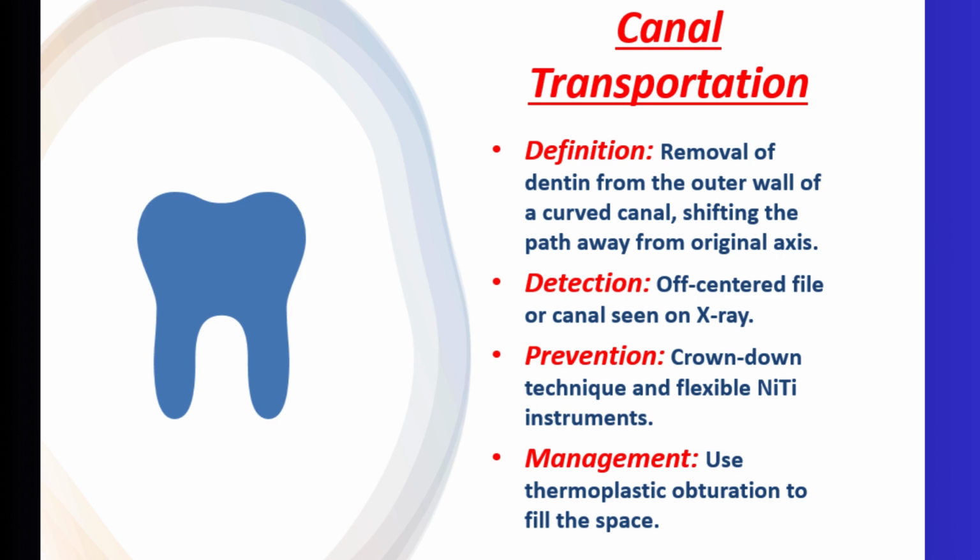Prevention: use flexible NiTi instruments. Respect original canal anatomy. Management: fill with flowable bioceramics. Modify obturation techniques accordingly.